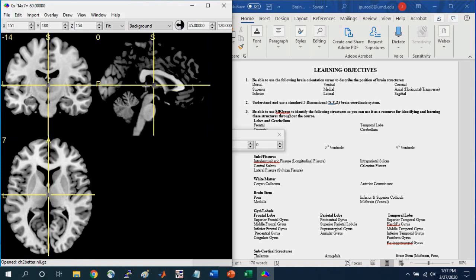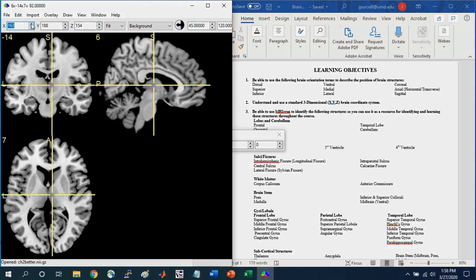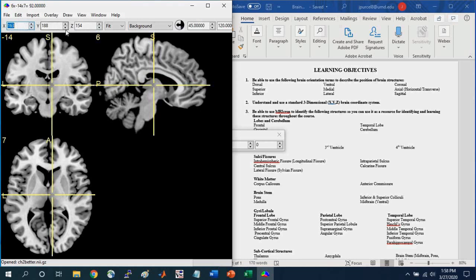Brains will come in different resolutions, so not necessarily in millimeter resolution. This can be highlighted by the other coordinate system shown at the top — you see X, Y, Z here, but these numbers don't match the XYZ coordinates in the MNI system. You can navigate using these toggles, and what these represent are essentially the coordinate system of the brain file itself, not necessarily standardized. It's going to vary depending on the resolution of the brain file. The MNI coordinate system is in millimeter space, but the brain file itself might be in half-millimeter space.